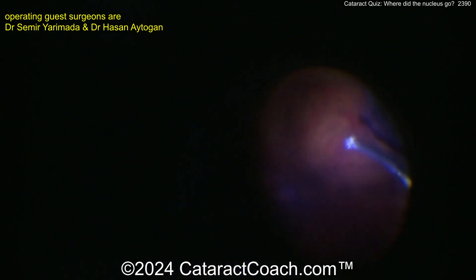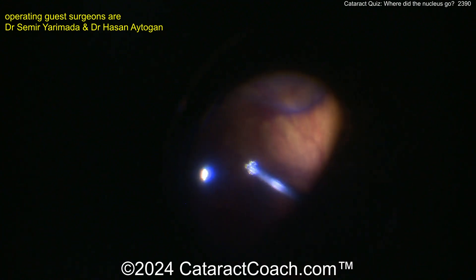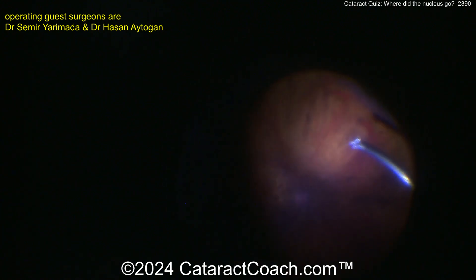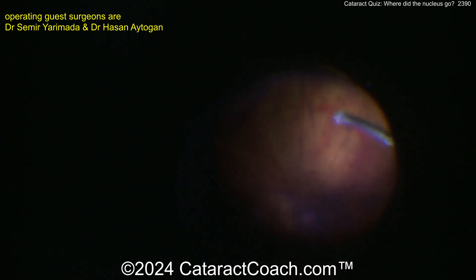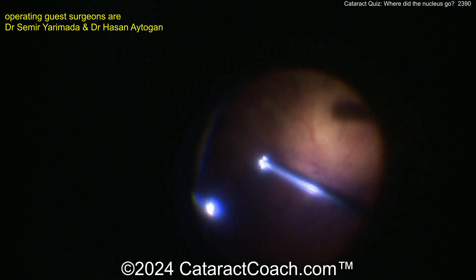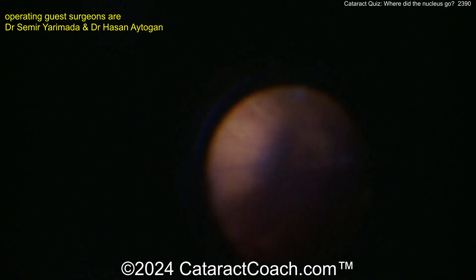This is an unusual case. We need a retina channel — retinarounds.com — so we can all learn together about retina cases. This patient has beta thalassemia, apparently, and the retina doesn't look its best.